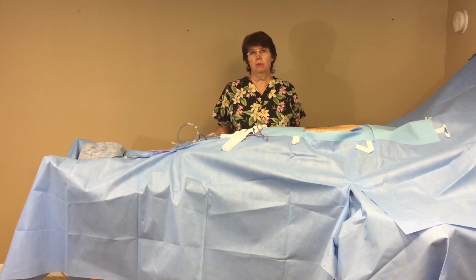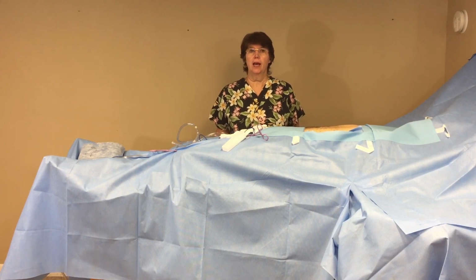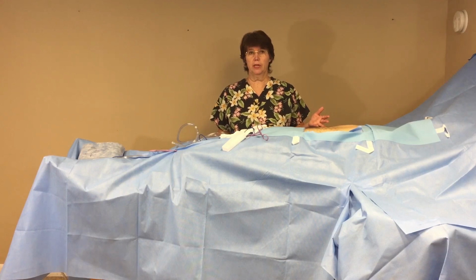What do you do if you're in the middle of a case that was supposed to be fairly simple and straightforward and it becomes more complicated, and now the surgeon wants a Foley in, but you're in the middle of a case, and usually, at least the ones I've had to do it on, have been abdominal cases. The abdomen's open, the field's open, and you want to preserve your sterility.